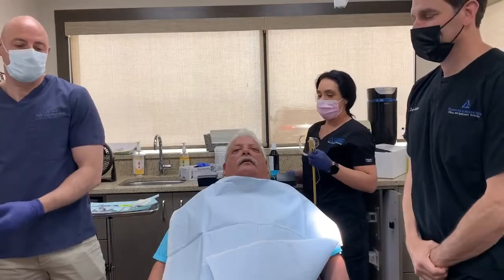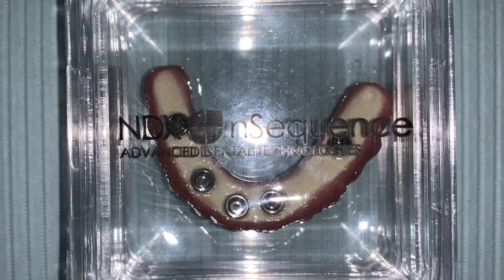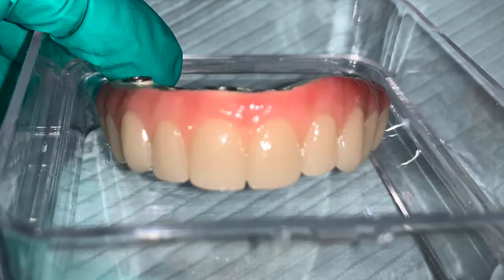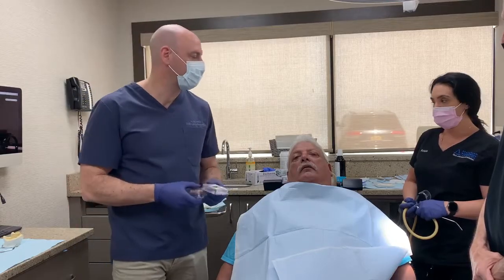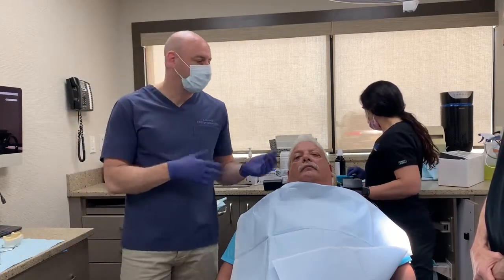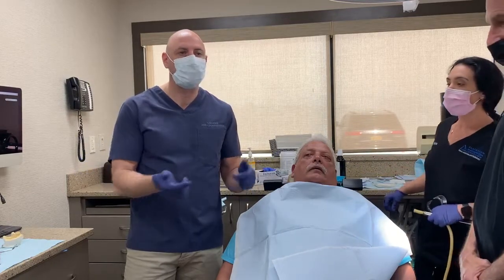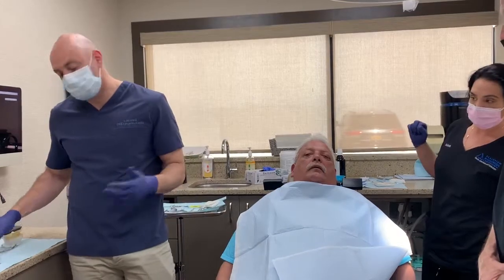All right, so we're here for the delivery visit for Jack. The definitive prosthesis that was fabricated by InSequence was your milled peak bar with the nano ceramic teeth. It's a replication of the setup that we tried in at the last visit. And so inserting this prosthesis is basically just like trying in the mock-up prosthesis. And we'll take it from there.